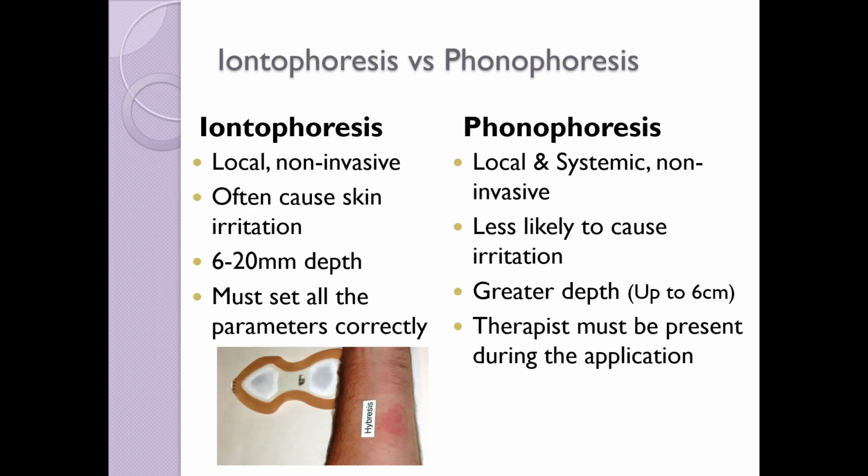One additional benefit to utilizing iontophoresis includes the fact that as a clinician, we can set the parameters of the machine and can essentially walk away during the treatment.